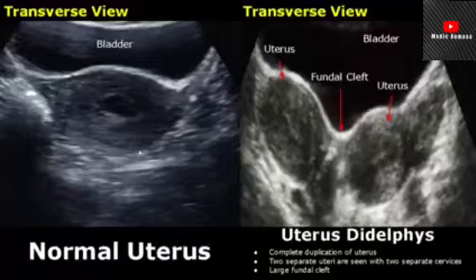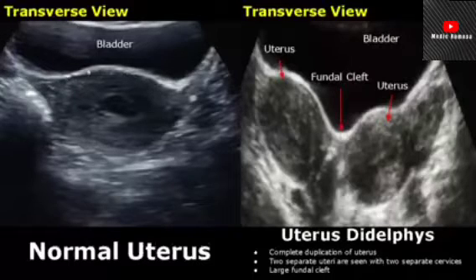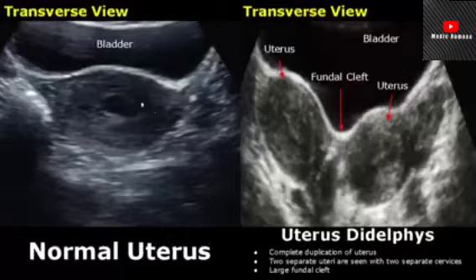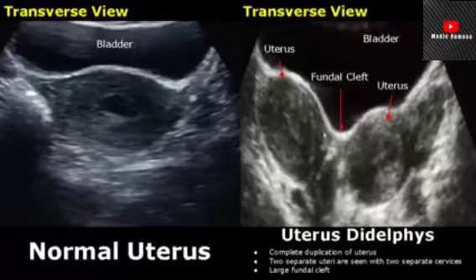These are transabdominal images of the uterus. On the left side is a transverse image of a normal uterus. We can see the normal myometrium and normal endometrial canal, with the bladder anterior to the uterus. On the right is uterus didelphys, in which there is a complete duplication of the uterus.